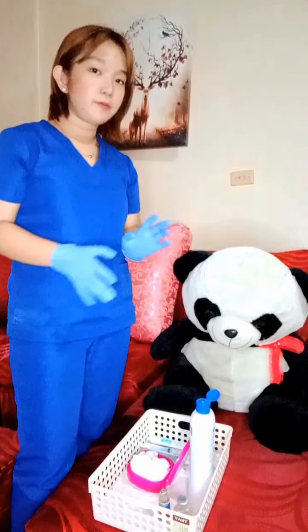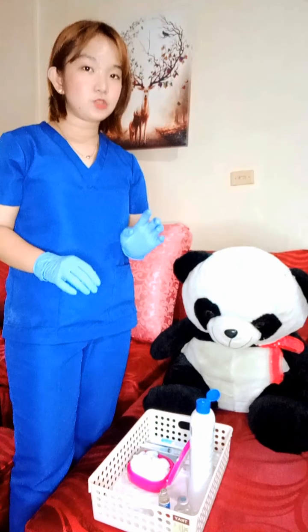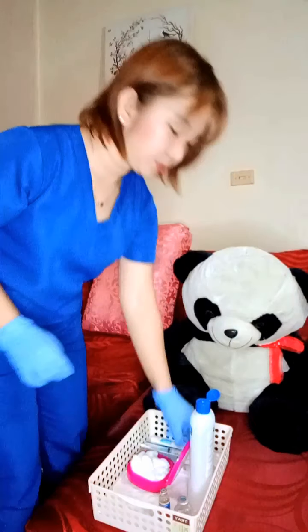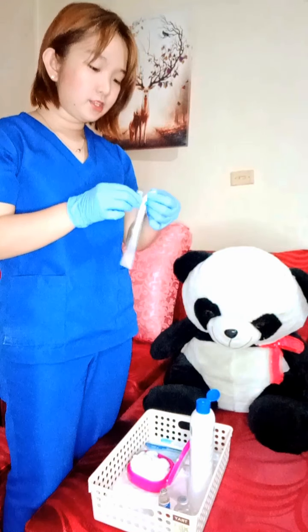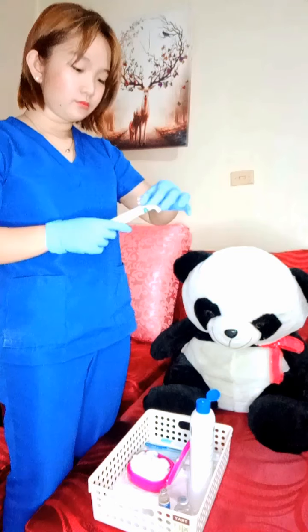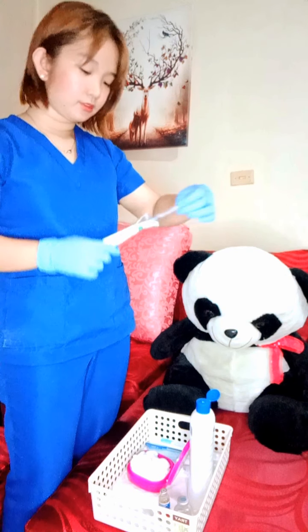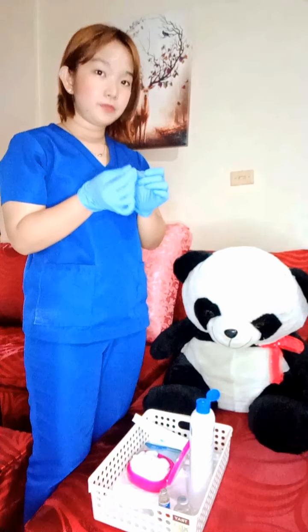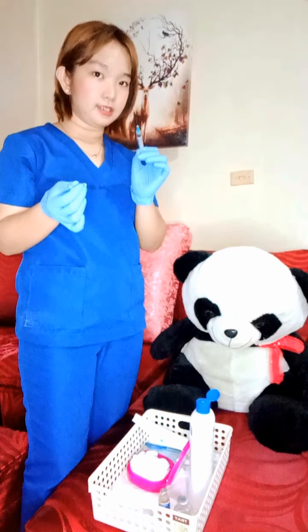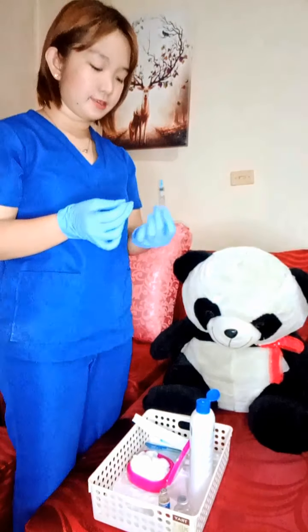The seventh step of the procedure is to prepare the syringe that we're going to use for the medication. Open the lid of the syringe and get the syringe. Pull the needle cap of the syringe without contaminating the needle, since it is sterilized.